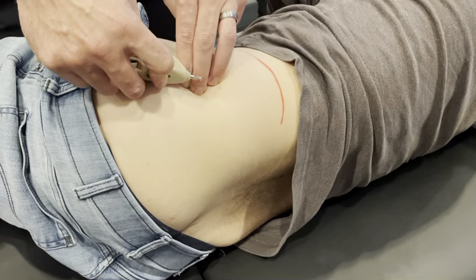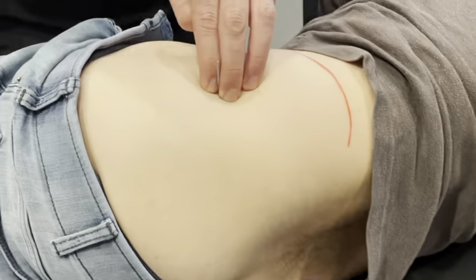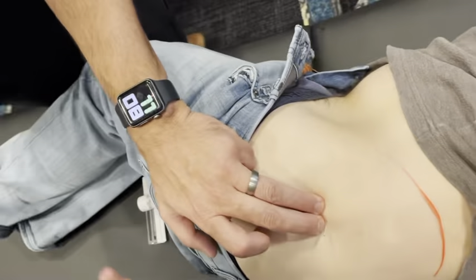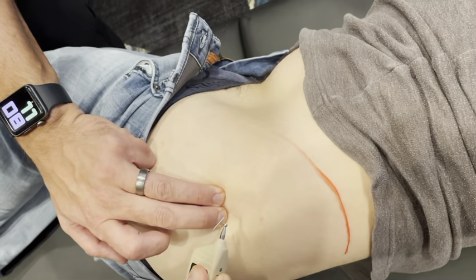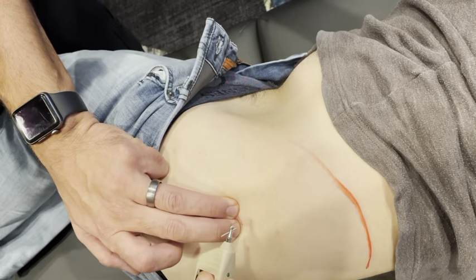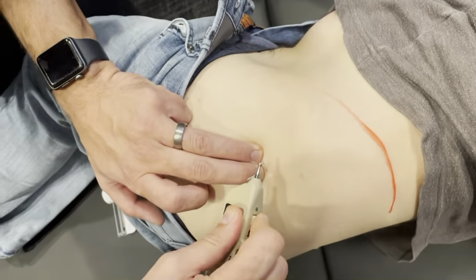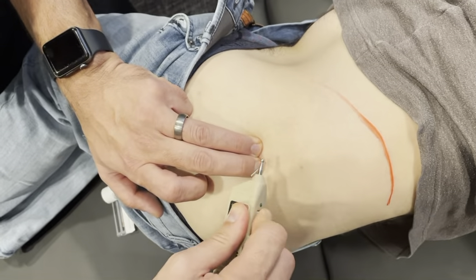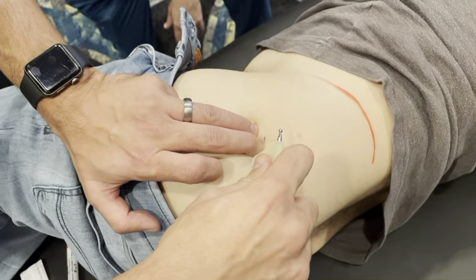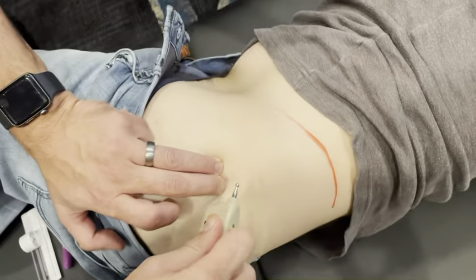We're getting movement — if you see from the front, we're getting co-contraction of the TFL. Watch — yeah, that's perfect. Because we go so deep, we get everything. And that's happening because we're getting co-contraction of muscles supplied by the same nerve — the superior gluteal nerve.